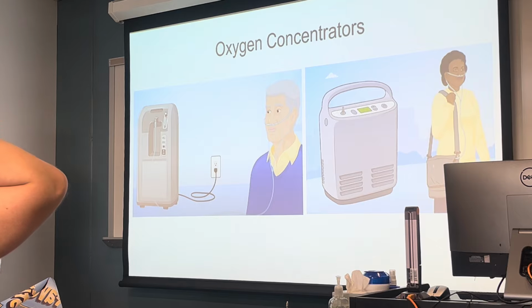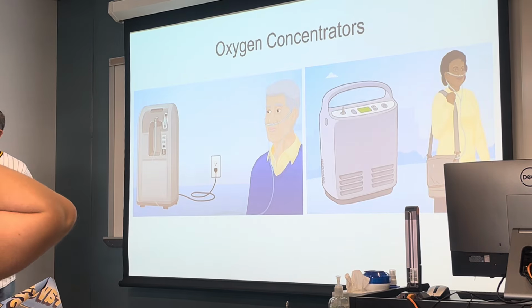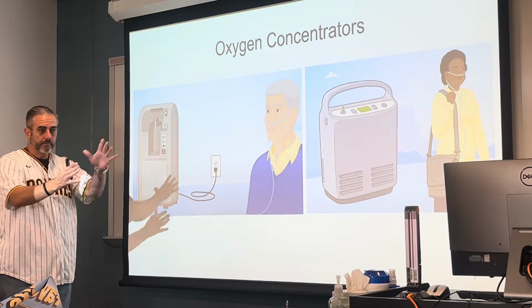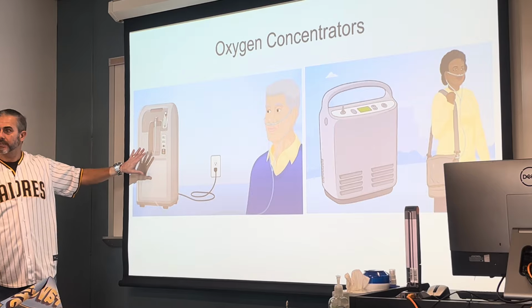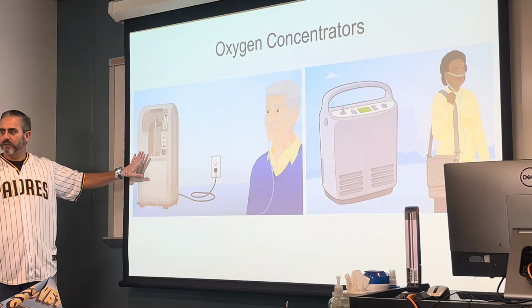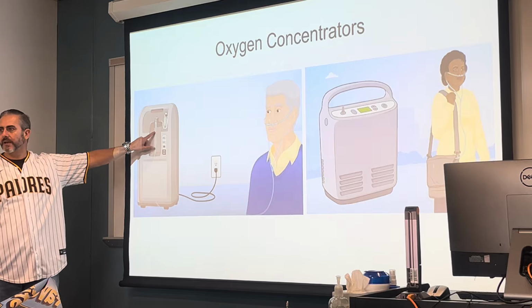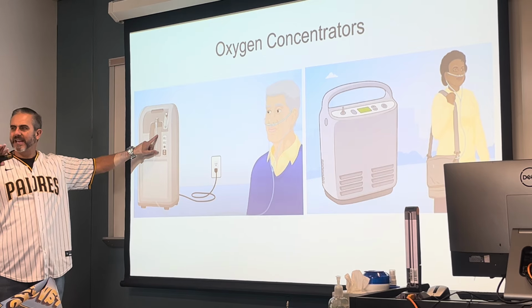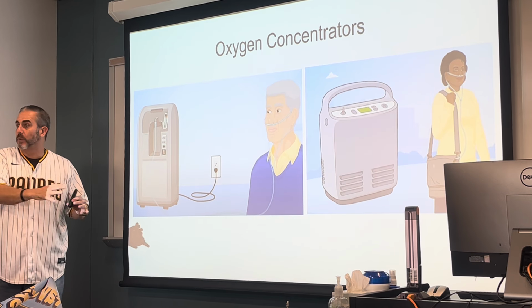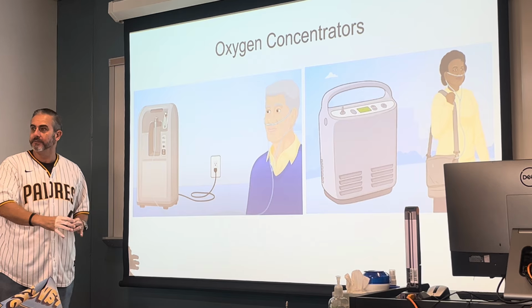So it's not like a large difference? Not a significant difference, but if you notice you've taken a patient from the oxygen tank to this, and their O2 sats start to dip a little bit, that probably explains why. Maybe you need to go just a touch higher here to make up for that difference, that they're not receiving quite as much oxygen as what was coming out of that tank.